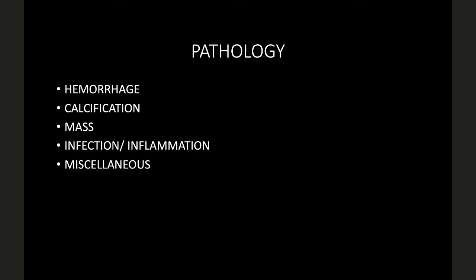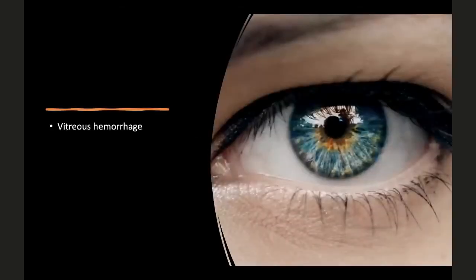Because imaging follows its own rules. So if I see something hyperdense and I'm thinking blood, because that's what I see, right? Then I need to go down a particular tree. And yes, some masses can have hemorrhages. Sometimes it can just be idiopathic trauma, whatever. We look at it based on the density or the signal changes. That's why I have come up with this. And yes, a lot of us follow this. It's not just mine.